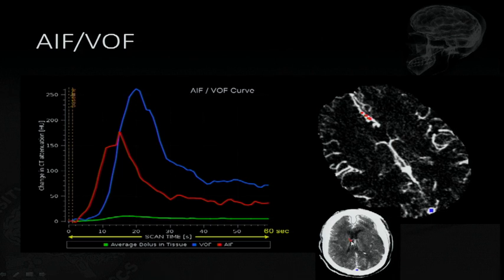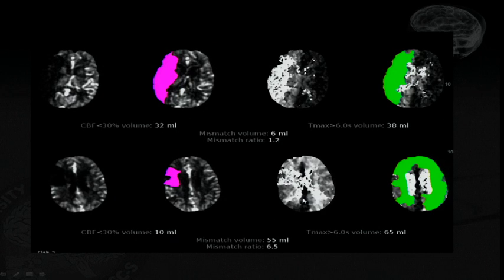That's the internal cerebral vein. And then the outflow is in the superior sagittal sinus, but the arterial input is nowhere near the A2 or the MCA. Okay, so that was a bad CT perfusion. So look at those warnings, look at this, make sure it's a good CTP.